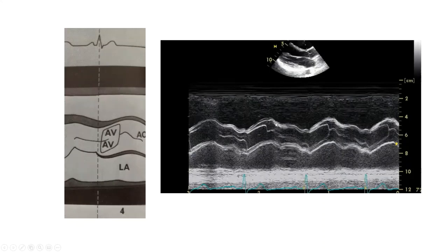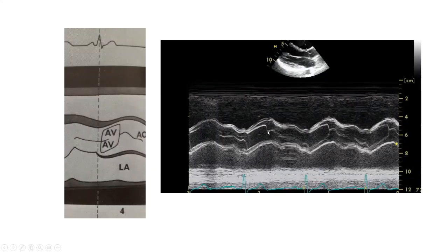Here's an M-mode echocardiogram through the aortic valve. The aortic valve motion is between the anterior and posterior walls of the aorta, and the motion of the aortic valve is a nice parallelogram shape. In general, you are seeing the right coronary cusp and the non-coronary cusp on the posterior side. The closure point of the aortic valve is generally in the middle of the aorta.